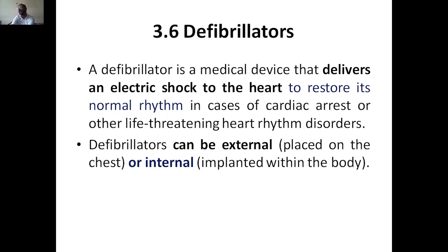Wherever there is a heart attack, we cannot rely on medicine, and there won't be time for implanting a pacemaker, which we just spoke about. That would also take time, as it is surgery, and by then the person won't be there. So in a short period of time we need to restore the electrical activity of the heart. For that we deliver an electric shock to the heart so that it restores its normal rhythm or normal beating process.